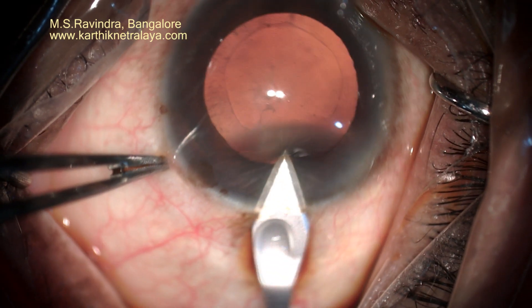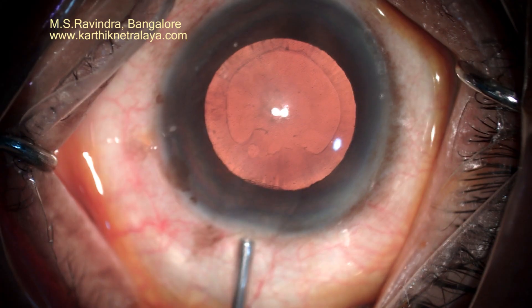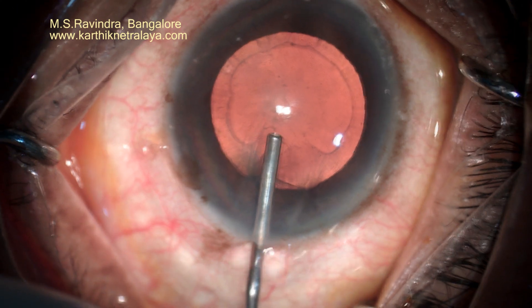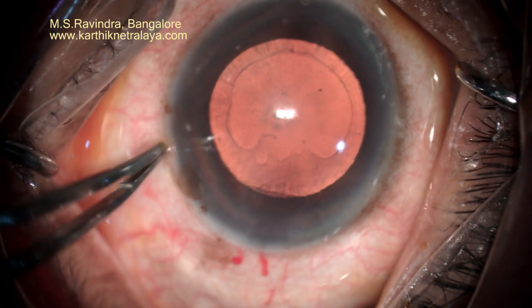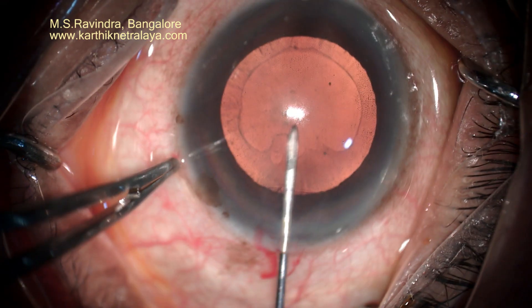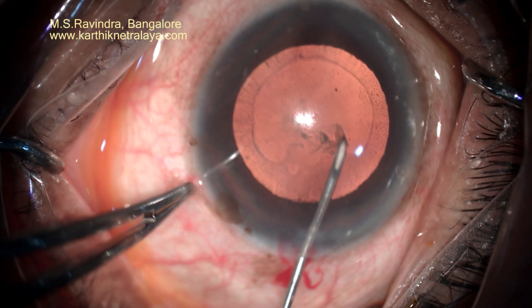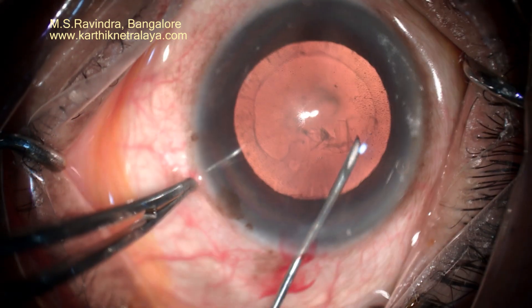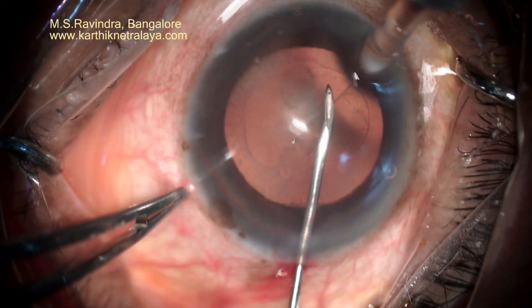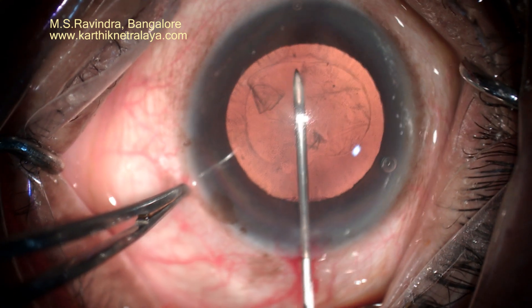Through the limbus and corneal stroma, a tunnel is created. Visco is filled into the anterior chamber. Rhexis is performed using a cystotome which enters the chamber at the limbus. Rather than passing through the length of the tunnel, I perforated the floor of the tunnel through the tip of the cystotome so that I enter the chamber through a truly tiny point.